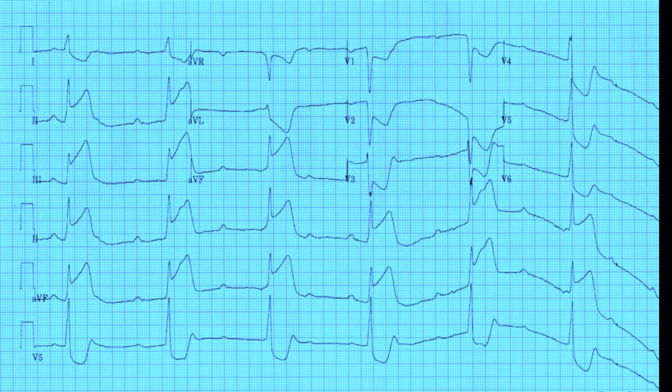In this ECG, make a mental note that these are junctional escape beats — the QRS complexes are arising from the AV node because complete heart block is present and the P waves are not conducting through the AV node into the bundle of His to stimulate the ventricles. The heart has to sustain life: if the SA node stops firing, the atrium takes over; if the atrium stops, the AV node takes over with AV nodal rhythm; if that doesn't work, the ventricles will try to sustain life with ventricular escape beats.